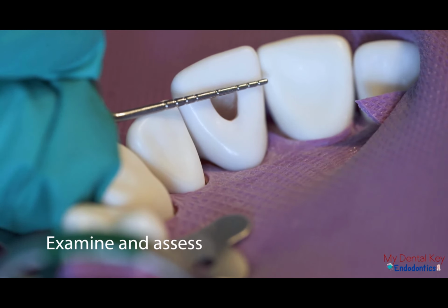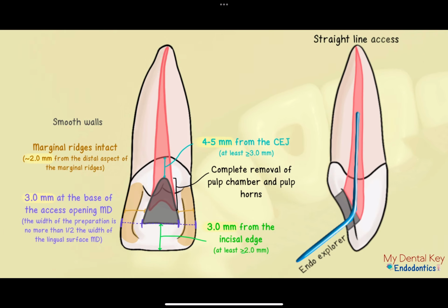You can assess your completed access opening using our procedure checklist. Avoid your prep being too small. This isn't operative. However, make sure your access doesn't get too large. Surpassing the following dimensions could also lead to a fail: less than 2 mm from the incisal edge, less than 3 mm from the lingual CEJ, and less than or equal to 1 mm from the marginal ridges.